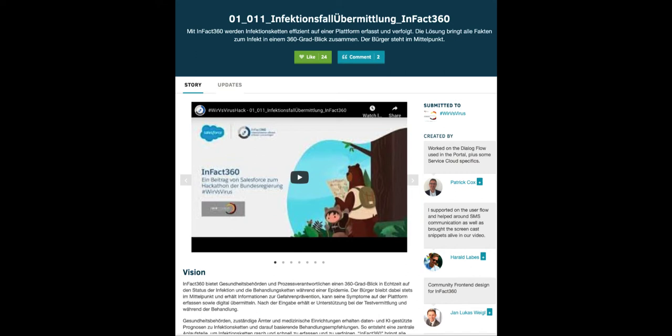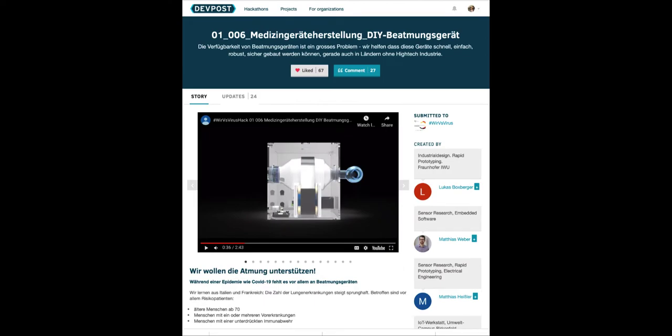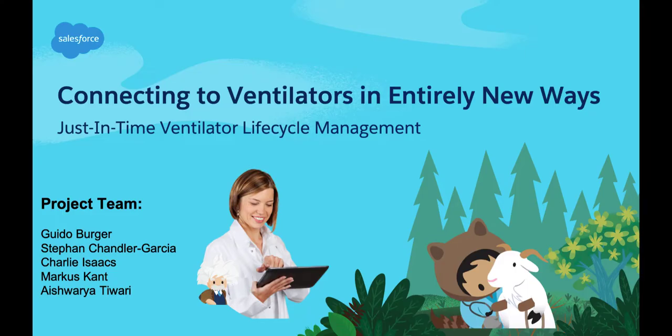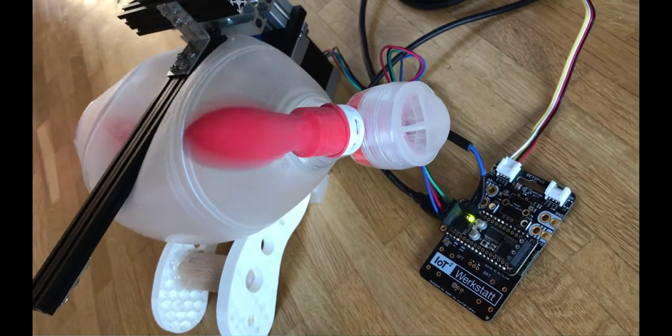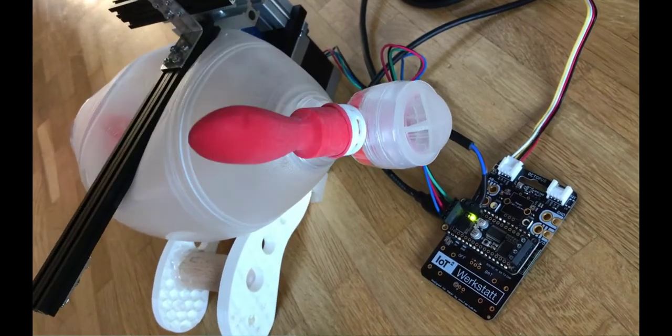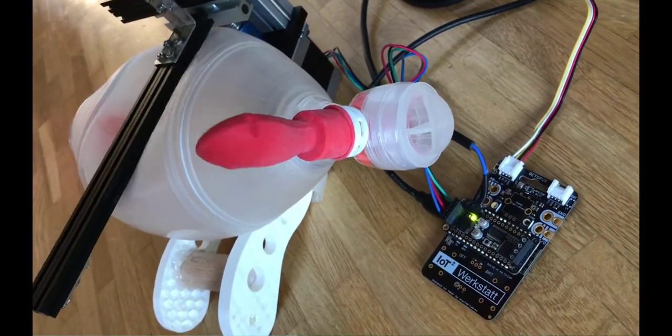These two previous hackathon open source projects are the foundation for our COVID-19 hackathon project called Connecting to Ventilators in Entirely New Ways. You're looking at a design here of a do-it-yourself ventilator.